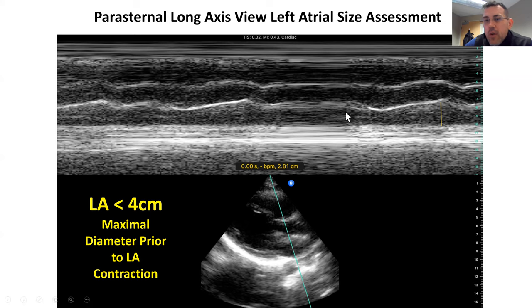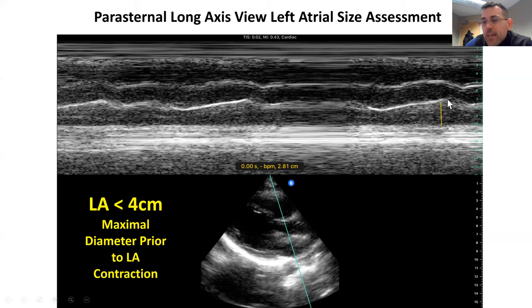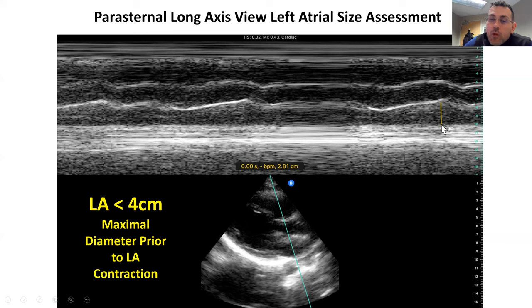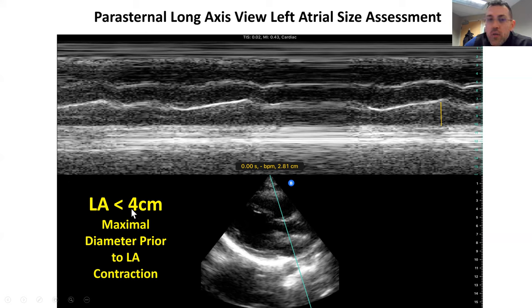This is convenient because you can see here systole, where this is shortening, and then diastole. What we're interested in is maximum diastole, and you can really see it well here in M-mode. We put our calipers across from wall to wall, and here we get a measurement of 2.81. A normal left atrial size is anything less than 4 centimeters. This is one way to do it with the M-mode.